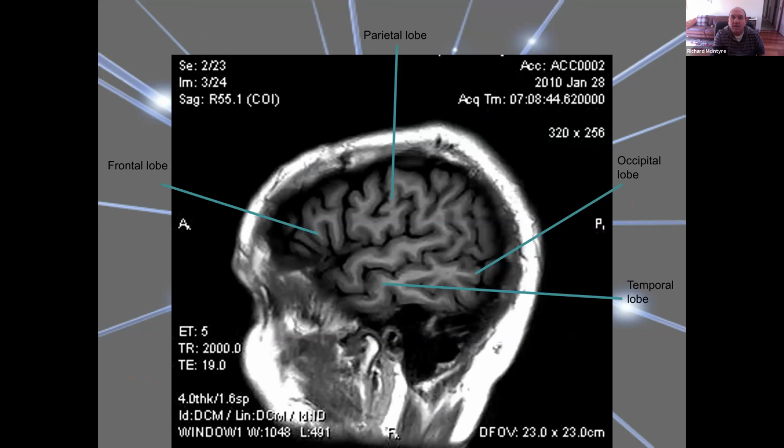Now we're going to look, so far we've seen that I'm just using that for imaging, but why don't we use MRI, instead of injecting contrast? Okay, so there's a really good question. Why don't we just use MRI for imaging blood vessels? Injecting contrast in CT scans is more invasive. Is there an advantage of using CT with contrast?